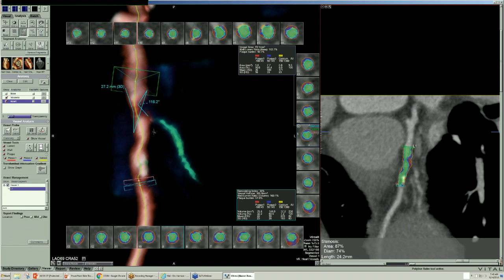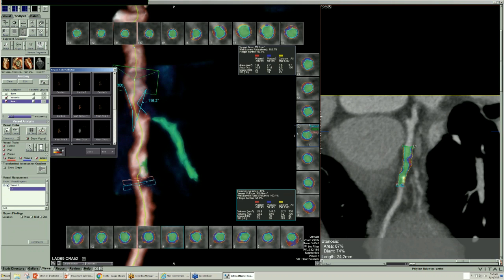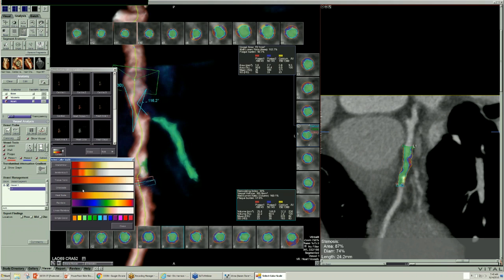And then we can color code this in various colors. And let's see how we can do that color coding. Hang on, there are other options we can do in terms of changing colors and editing colors and applying colors to what we're looking at here, and then changing the density according to color coding, showing us where the least amount of flow is. And we can come over here and use a single color. We can use whatever color we want in defining this as we measure it.